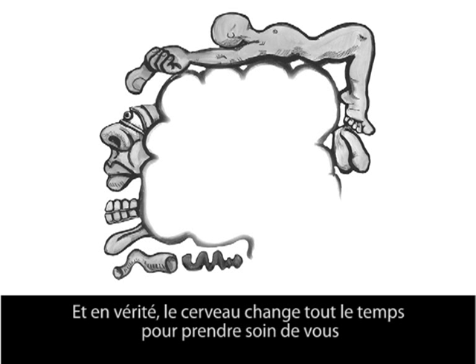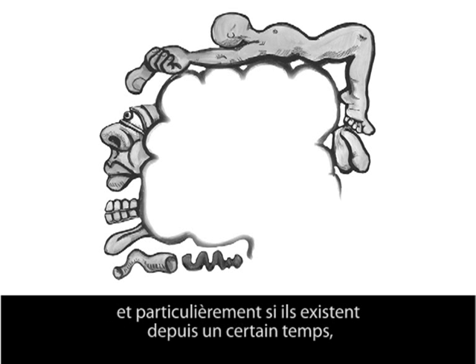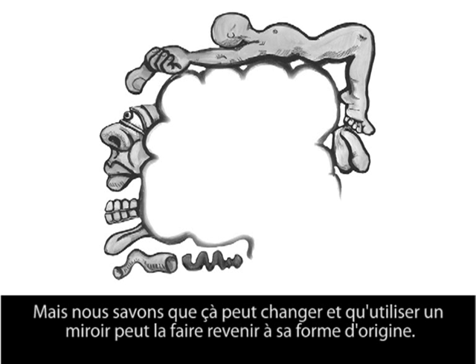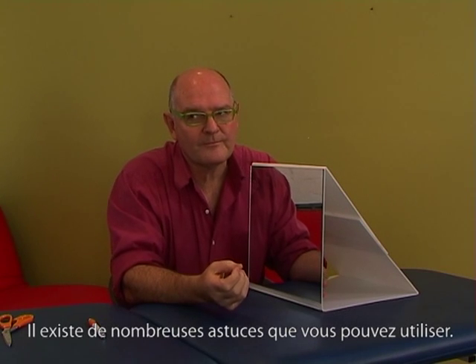And actually the brain changes all the time to look after you. What we also know is that if you have a pain problem in your hand, and particularly one that's been there for some time, and particularly where the hand hasn't been used properly, the hand in the brain will change shape. Very often getting larger, kind of smudgy, sometimes smaller, but we know it's changed, and we do know that using a mirror can bring it back to its original shape.